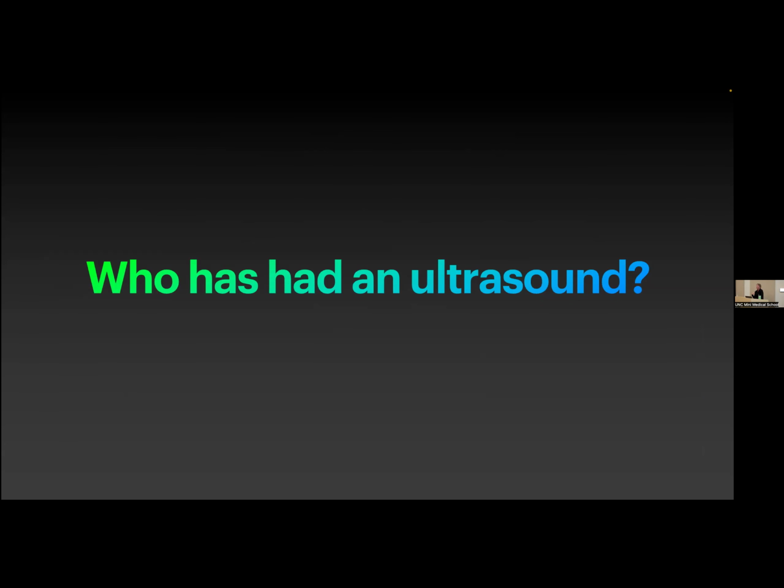sometimes there's bowel in the way, like there's gas in the way, and that's a problem for ultrasound. And so things that are deeper inside the body might be harder to see by ultrasound, or things that have something in the way of it are going to be harder to see by ultrasound. And on the other hand, if you had a CT, you might be able to see all the organs within the deeper layers of the abdomen. So that's, I think, a really good point of trying to figure out what are the limitations of ultrasound, and can we always expect to see the appendix? Oftentimes not. And so I'm not going to give any medical opinions here, and I recommend you consult your physician.